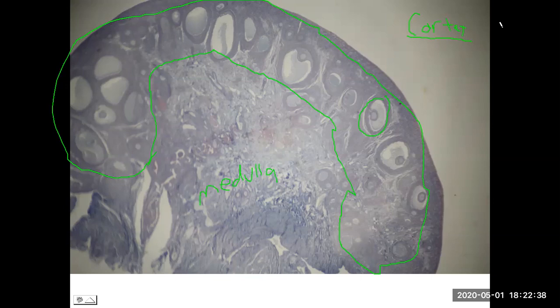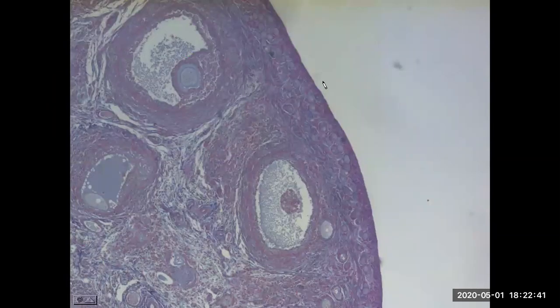The ovarian cortex versus ovarian medulla, lacking any follicles. So starting out with the cortex, we want to look very close to the surface. And again, that's where we find the area of the tunica albuginea. It's not the absolute surface, but very close to the surface. And now, just deep to that layer is where we find the multiple, they're called primordial follicles, just these small little areas right here that I'm circling. There's multiple, very close to the tunica albuginea, multiple primordial follicles.